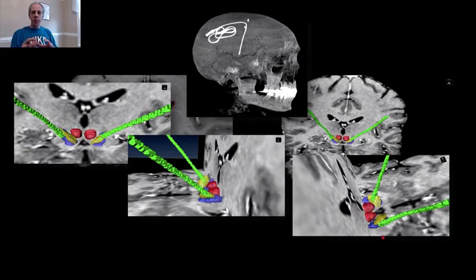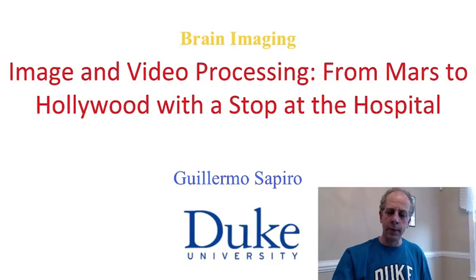So a lot of image processing: we do registration from the different modalities, we do segmentation, and that helps the neurosurgeon localize himself or herself inside the brain of the subject to better do the surgery, of course doing it safer as well, and in the same fashion, after surgery, to do a better programming and understand what was the actual outcome of the surgery.